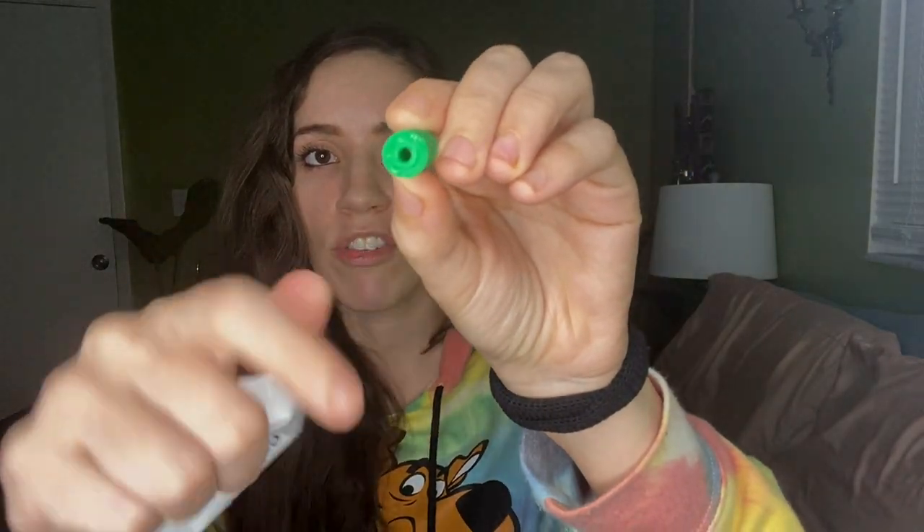These are chewies that they give you at the orthodontist office. This one is brand new. It's basically like a little sponge — a really hard sponge, not that gushy. What you do is bite on it really hard, like that — to make sure that your aligners are seated in the correct space, because the buttons need to be attached properly and tightly. That's the full point of chewies.